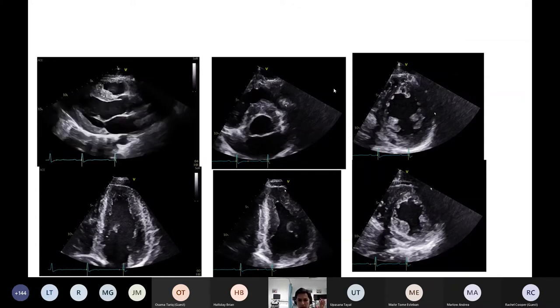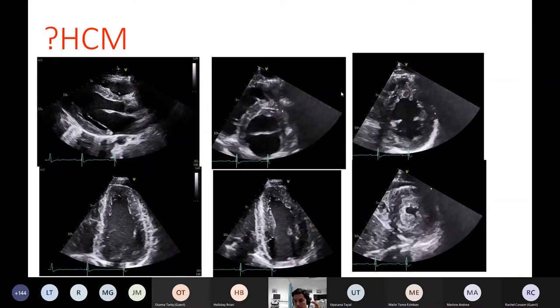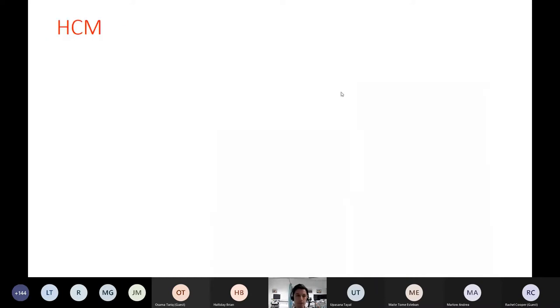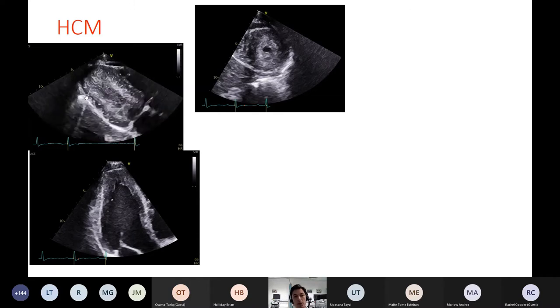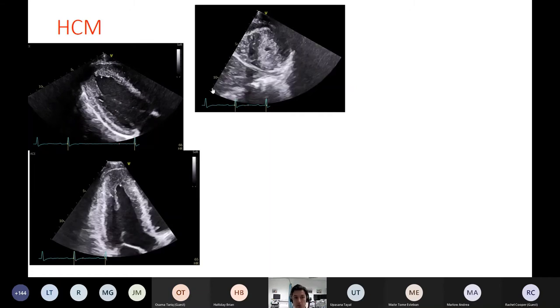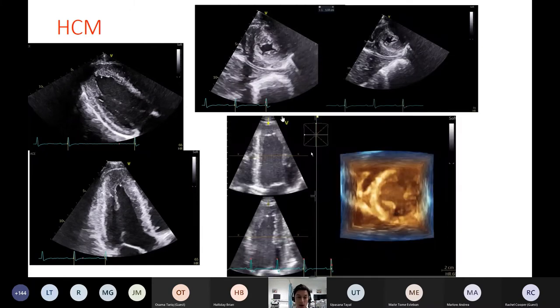Can we see any abnormalities in this one? Now, I think we might say, well, the papillary muscles look a little bit chunky and maybe the apex is obliterating a little bit. Maybe you'd say maybe I want to see some more views or imaging is needed. So if we do a parasternal long axis view, but take the probe down a couple of centimeters or rib spaces, we can notice that we have the very prominent apicalized papillary muscle here, and that's not even as prominent as it would be in the apical three chamber view. And indeed, the apex here is quite chunky.